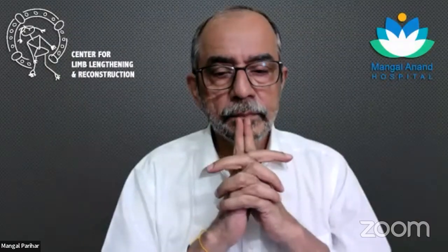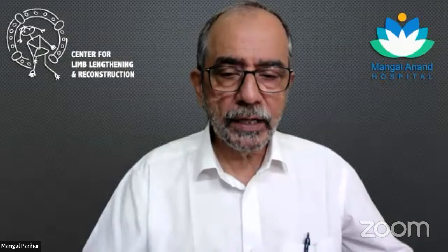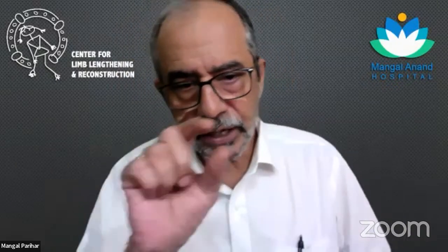Okay. Sir, in the biplanar osteotomy that has been described classically for Tomofix, the vertical limb goes up towards the knee joint. Yes. And they say if the requirement of the opening of wedge is more, you can do it inferiorly also. Yes. Now, would it be okay if, as a routine, we do only an inferior cut, not the superior cut? No, the inferior cut has got a lot of problems in terms of it's a very thin part.